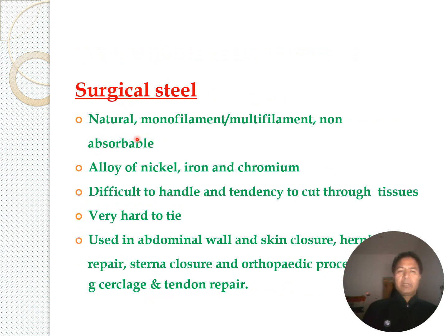Surgical steel: monofilament or multifilament, non-absorbable, an alloy of nickel, iron, and chromium. It is difficult to handle, has a tendency to cut through tissue, and is very hard to tie. It is used in abdominal wall and skin closure, sternal closure, orthopedic procedures, cerclage, and tendon repair.